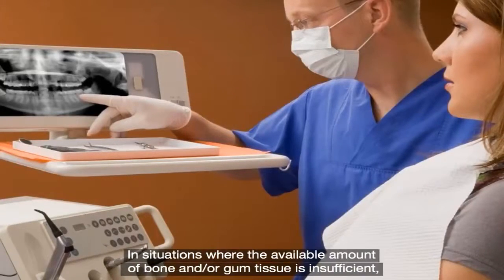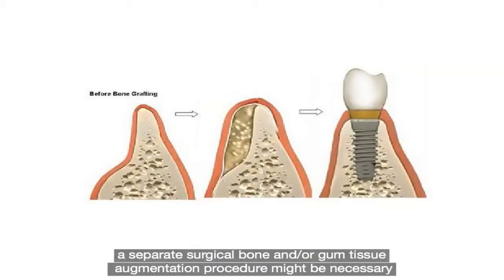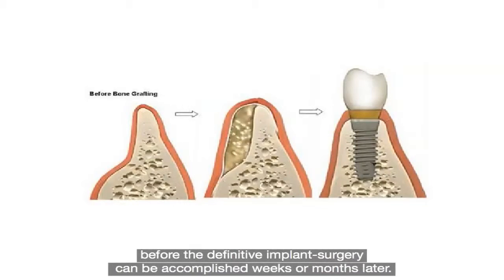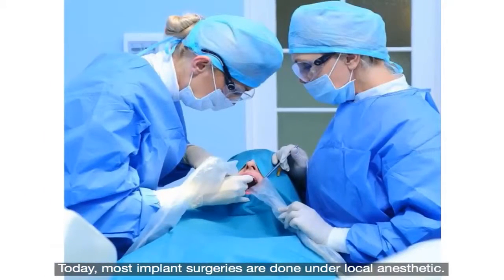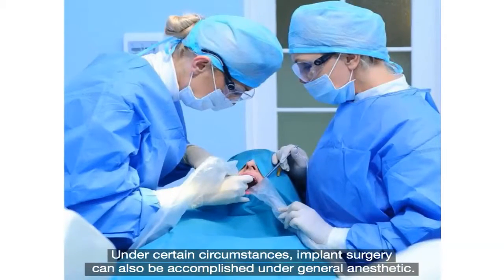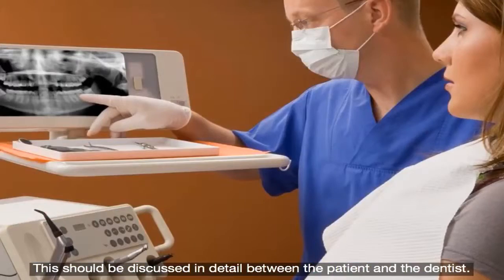In situations where the available amount of bone and/or gum tissue is insufficient, a separate surgical bone and/or gum tissue augmentation procedure might be necessary before the definitive implant surgery can be accomplished weeks or months later. Most implant surgeries are done under local anaesthetic, though under certain circumstances implant surgery can also be accomplished under general anaesthetic. This should be discussed in detail between the patient and the dentist.